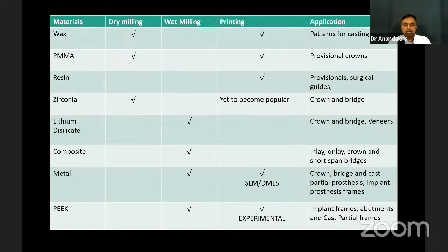So if you've made a mandibular frame, for example, and there is mandibular flexure, this flexure flexes the jaw, but if the framework doesn't flex, like one made with zirconia, there's always a stress concentration, so that you can have fractures in your frame. That's the reason why many mandibular frames done from molar to molar fail. In such scenarios, if you use something like PEEK or bio-HPP, they are flexible materials. They have the same modulus of elasticity as bone, so they also flex and you do not have fractures. That's the whole idea by which PEEK frames are made.